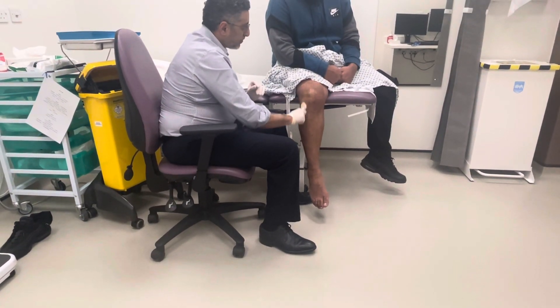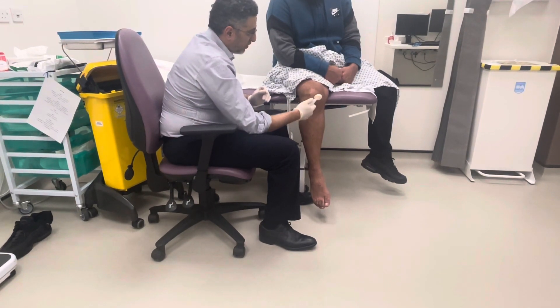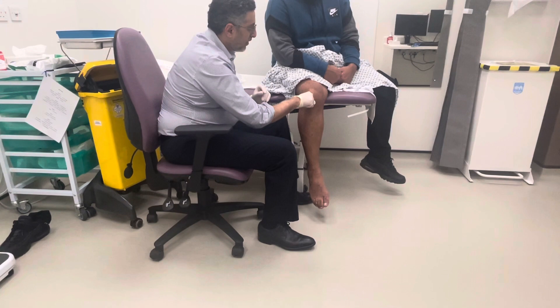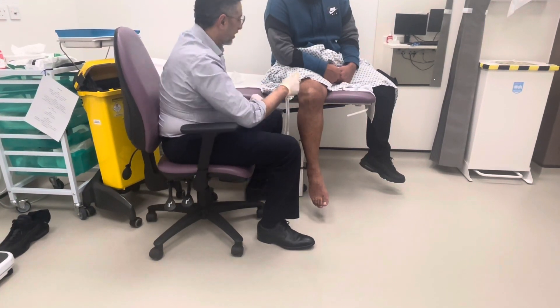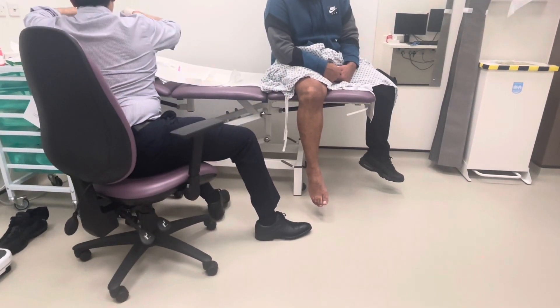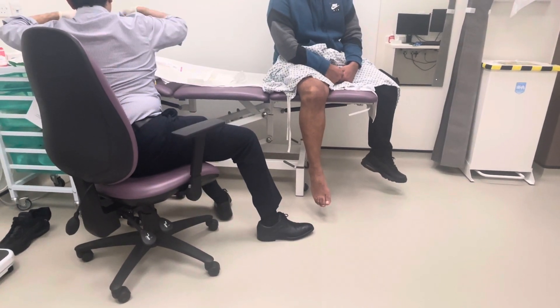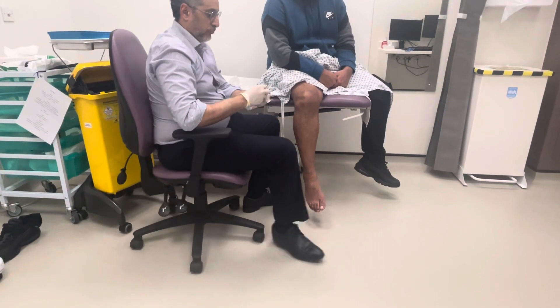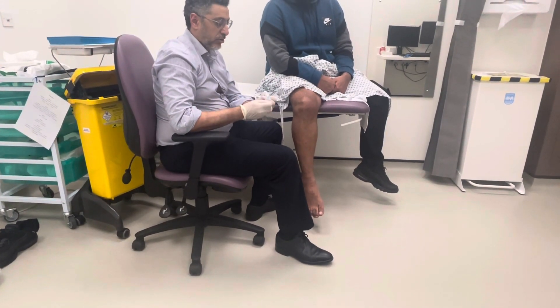So once we've done this, there's a landmark — this is the lower pole of the patella — and I'm going to go right beside this. I've prepared the local anesthetic from before that I'm going to give the patient.